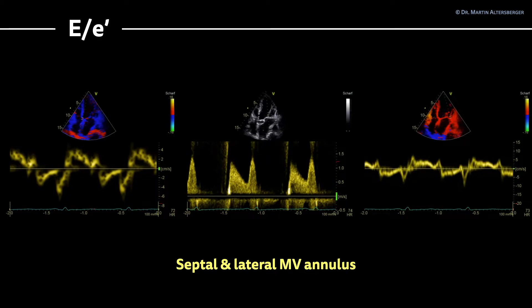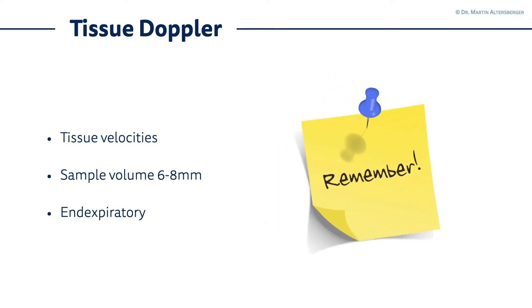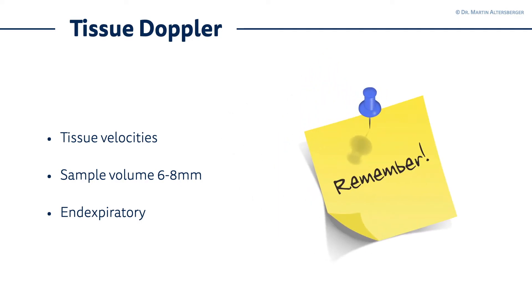To put this into a measurement for sick left ventricles, we calculate the E-to-E-prime ratio using the E wave and the E prime of both the septal and lateral mitral valve annulus. Some important tips for tissue Doppler: it measures tissue velocities, which are lower than blood flow velocities, so use the specific TDI preset. Set the sample volume to approximately 6 to 8 millimeters. Also, ask the patient to exhale — placing the sample volume in expiration can improve image quality.